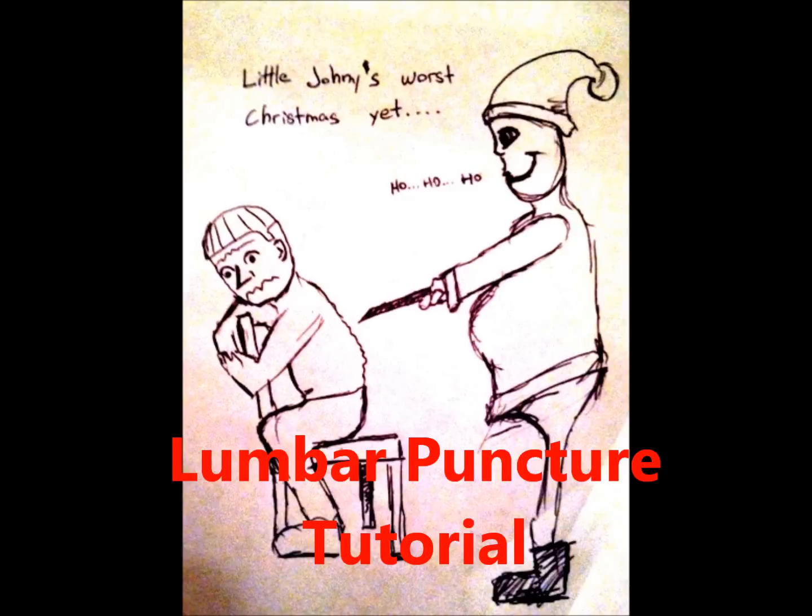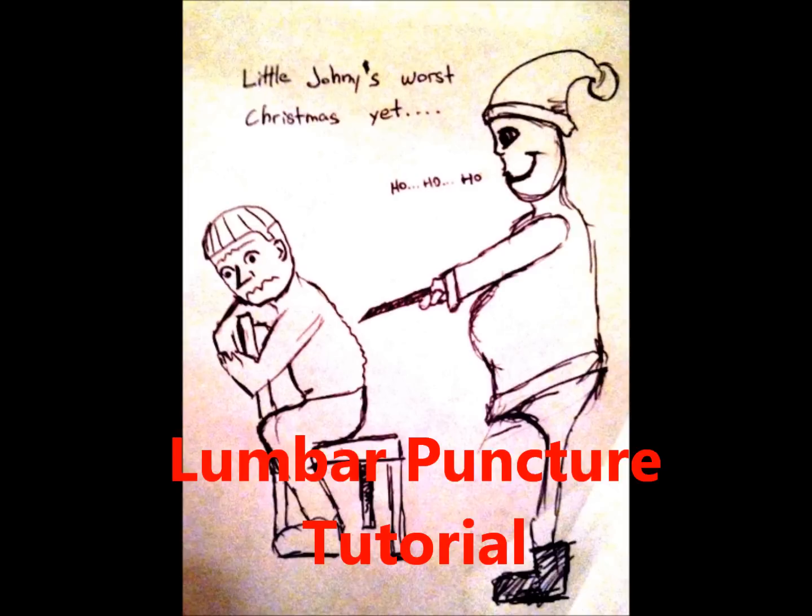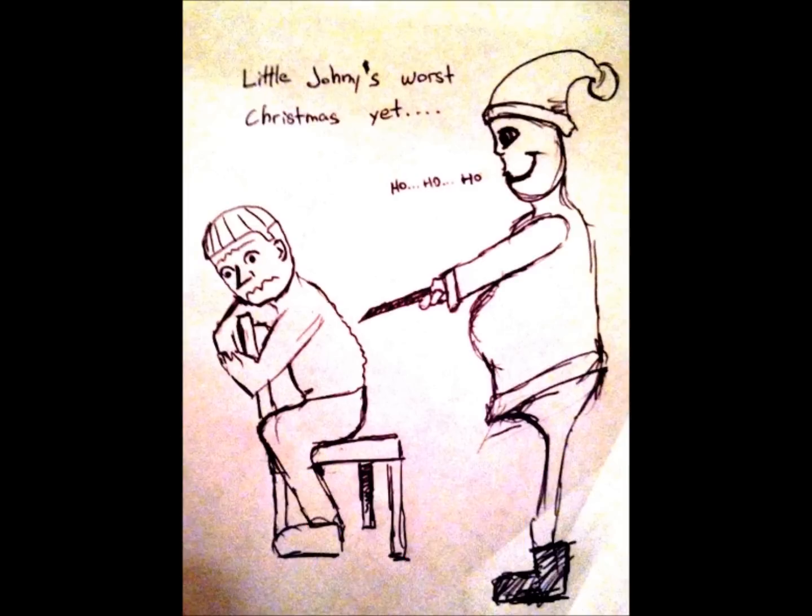Today we are going to be performing a lumbar puncture, which began in December 1890 on a 21-month-old boy with a stiff neck.